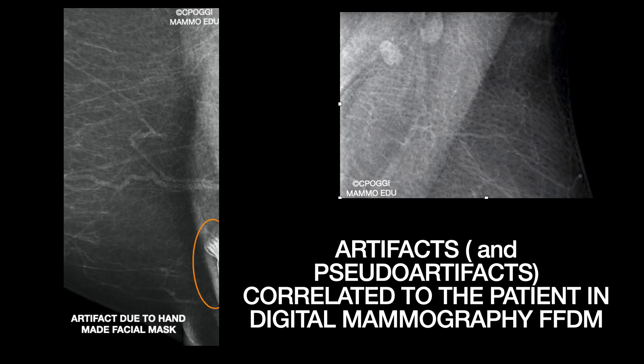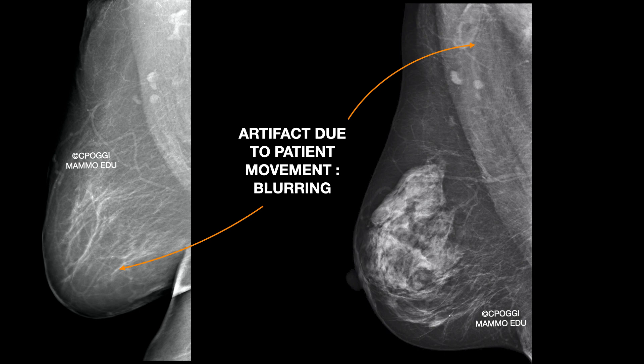Let's talk about the artifacts and pseudo-artifacts correlated to the patient. These are examples of blurring due to patient motion during acquisition. In the first example, the artifact could be due to sub-optimal compression of the breast's rear portion, so it should be ascribed to poor positioning. In the second example, motion blur of axillary tissues.